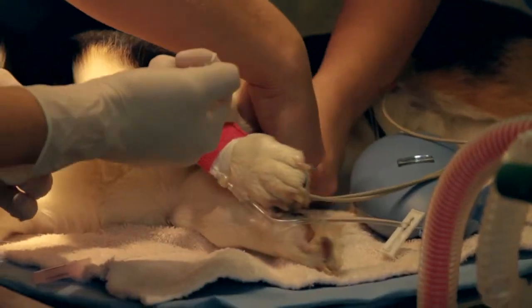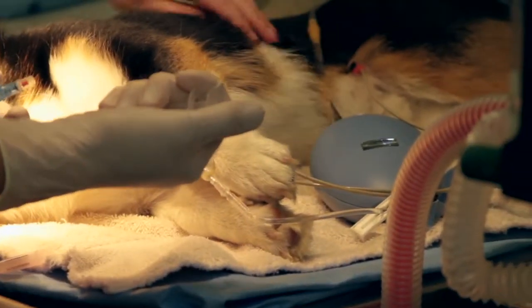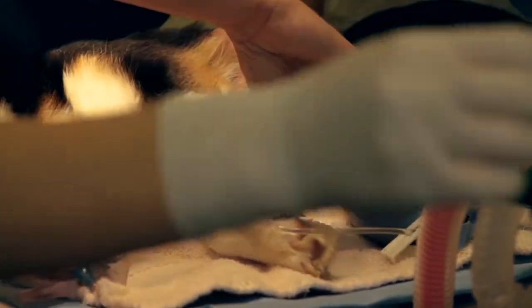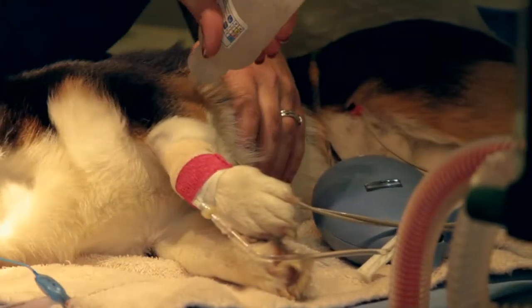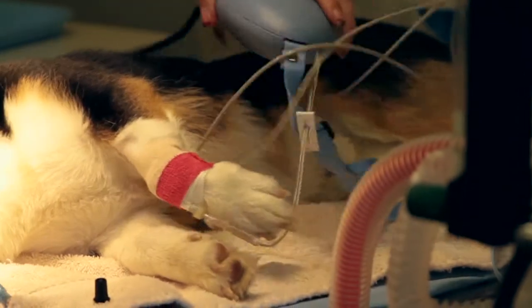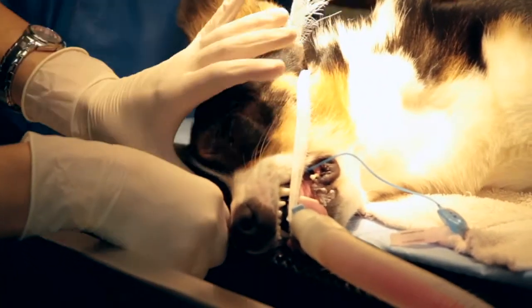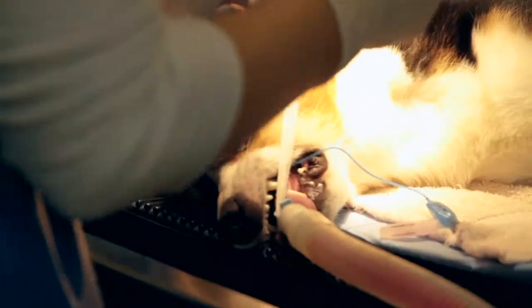They're good. So Miss Dallas is hooking up the EKG, also known as ECG, and it will monitor the electrical rhythm of the heart, so we can monitor arrhythmias and treat them as needed. You'll see Miss Chiquita is putting eye ointment into SNAP's eyes, because the eyes don't close when critters are asleep like this, and we don't want the eyes to dry out.